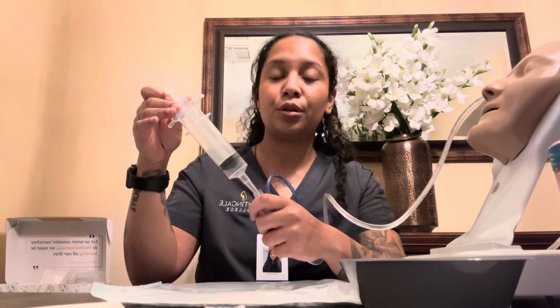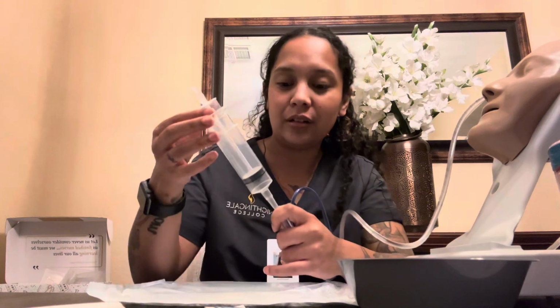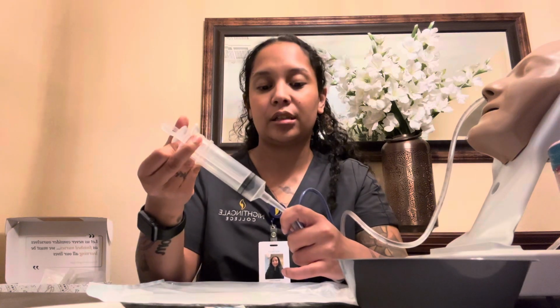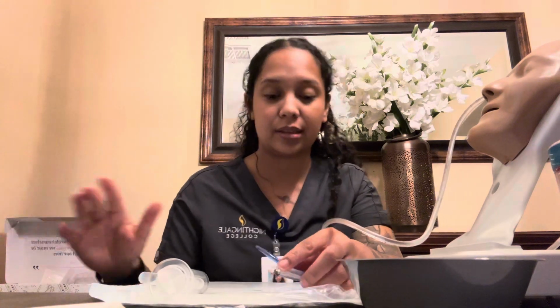And if we do, per the facility, if we have testing strips, we would put it on the testing strip and it should be around a pH balance of 3.0, 3.5, around there. And we would just dip a little bit and test it. Or, at the facility where I work, we just do the x-ray to verify the placement. That's our best bet.